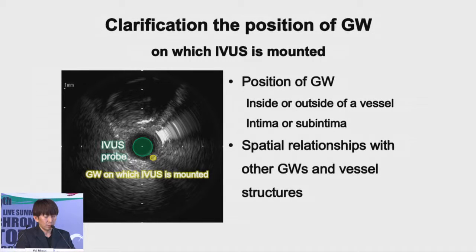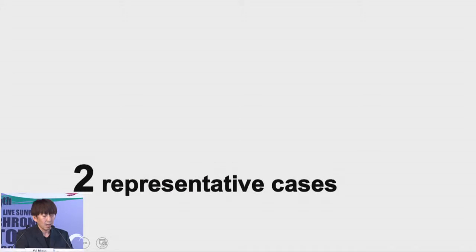At 2 o'clock, we can see the hierarchical structure. This is another wire. I should handle this wire toward the true lumen at the 12 o'clock, counterclockwise. I will show you two representative cases.